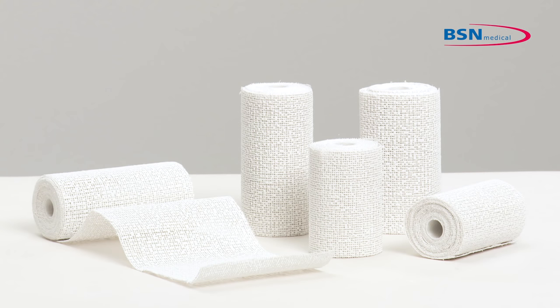For indications where immobilization of the wrist is required, for example, distal fractures of radius and ulna.